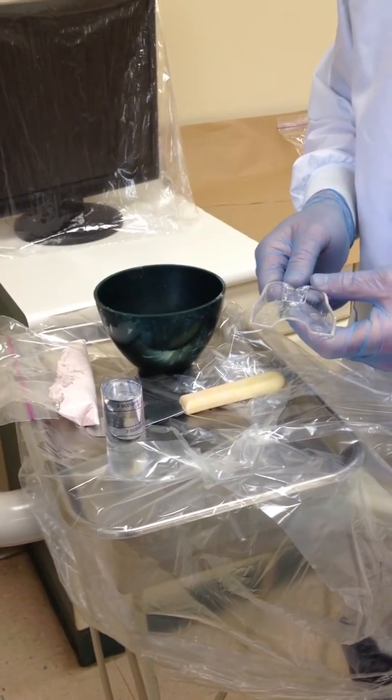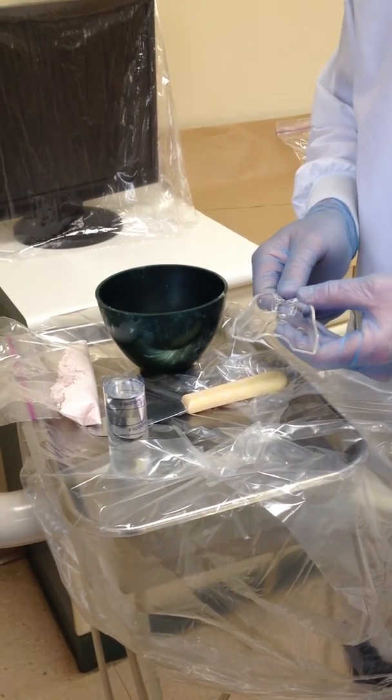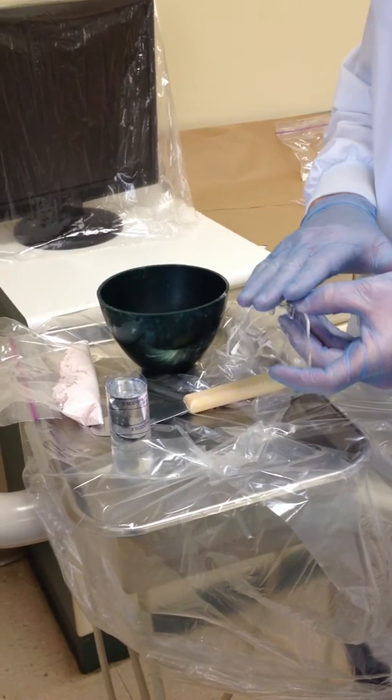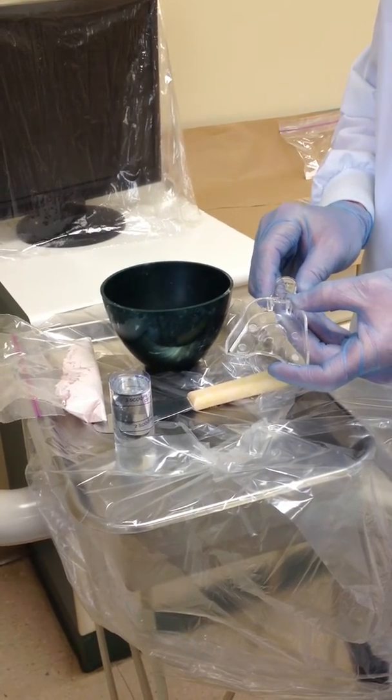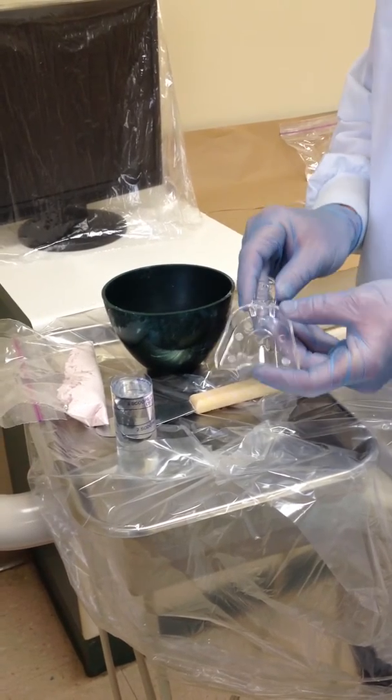We are going to go through the process of taking a maxillary alginate impression on our patient. We have all of our armamentaria here. We have a tray that we've already fitted to the patient's mouth. This is a small size tray — she would like to think she's a medium, but she is a small.